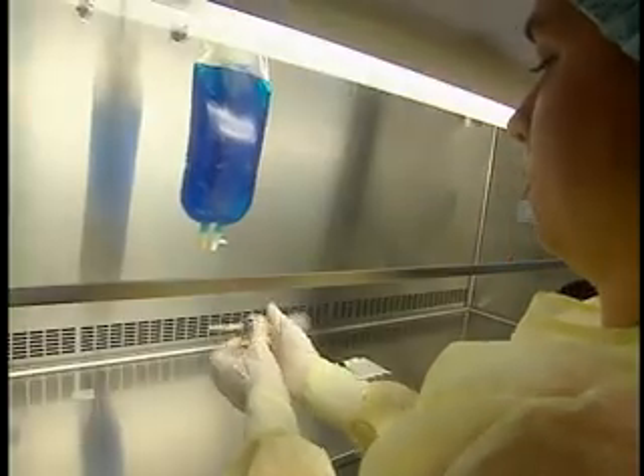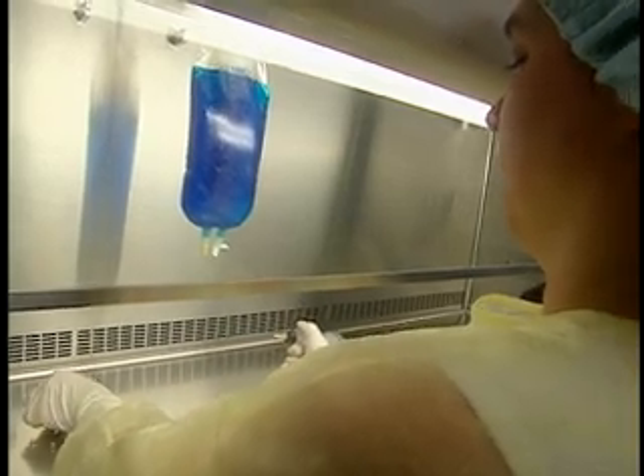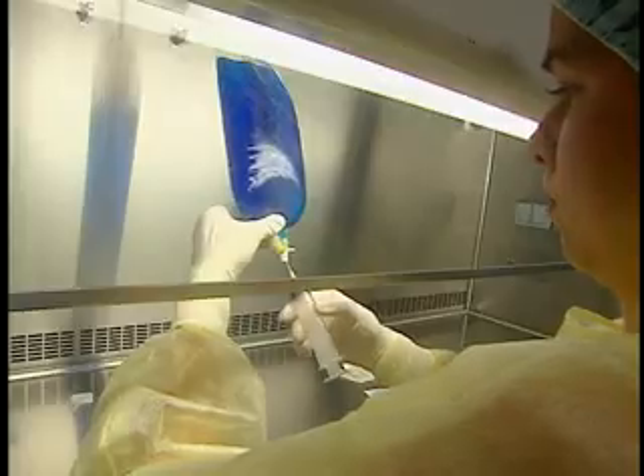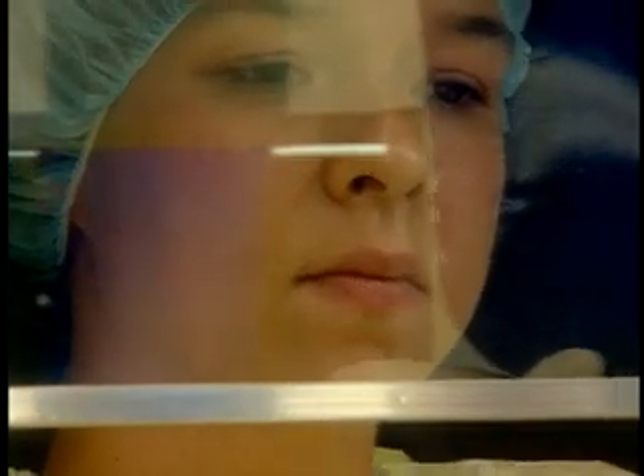Push on the plunger to expel air from the syringe. Remove the needle guard. Lift the end of the bag, taking care not to contaminate the injection port or to disrupt the laminar airflow with your hands.